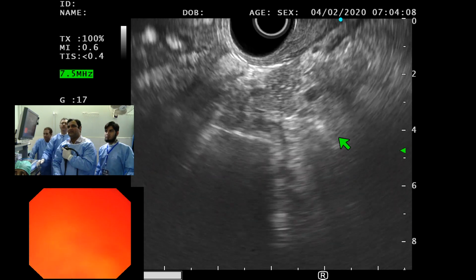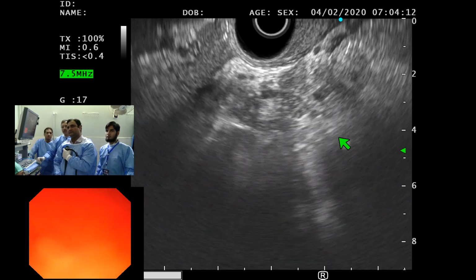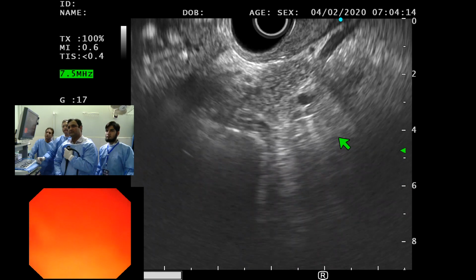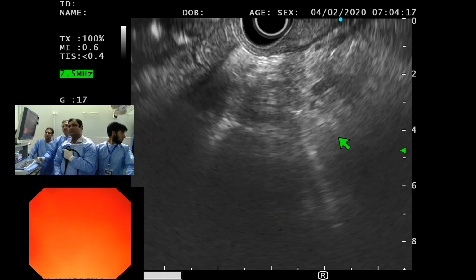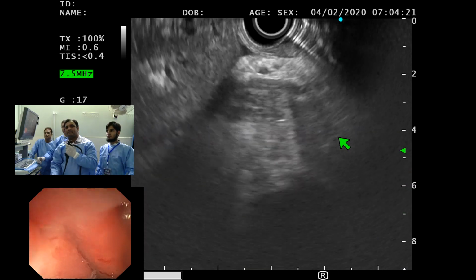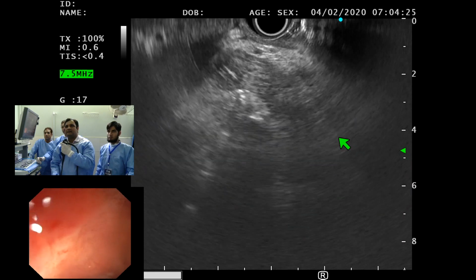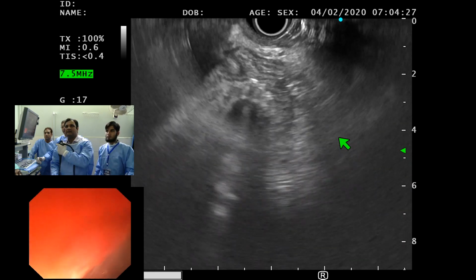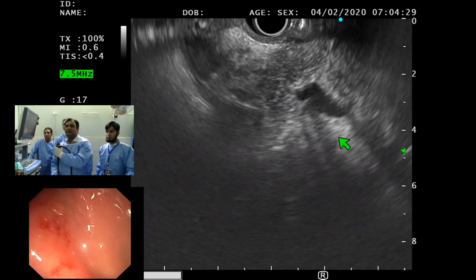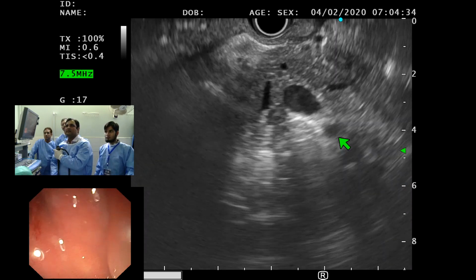Personally, I don't prefer using a balloon in the D1, and to be honest, with a linear scope, I don't use a balloon either. I like you, Riaz, but I've seen some experts. Khalid sometimes likes to use a balloon. Sometimes they use it, sometimes they don't.